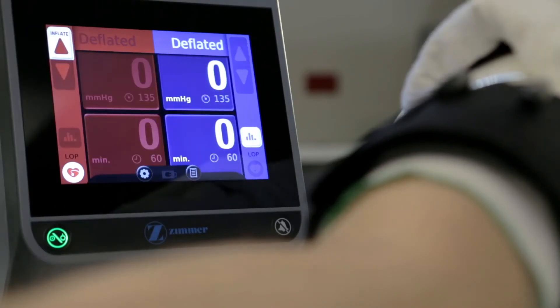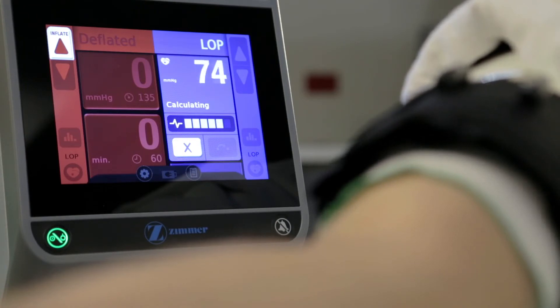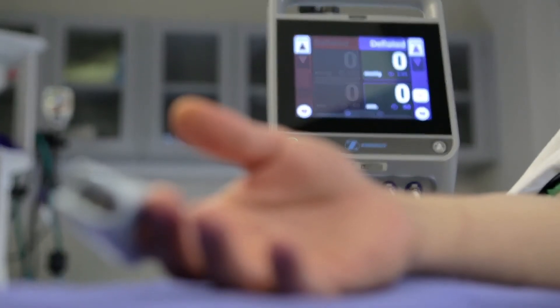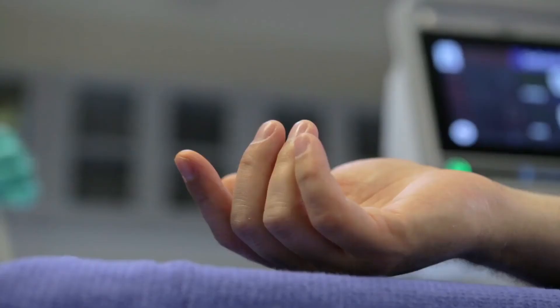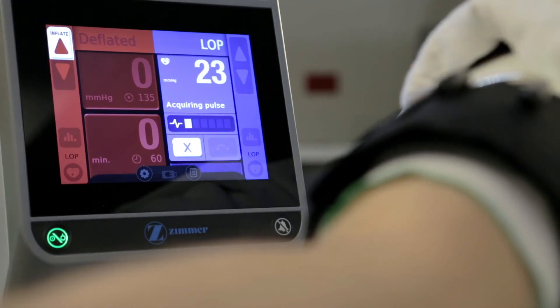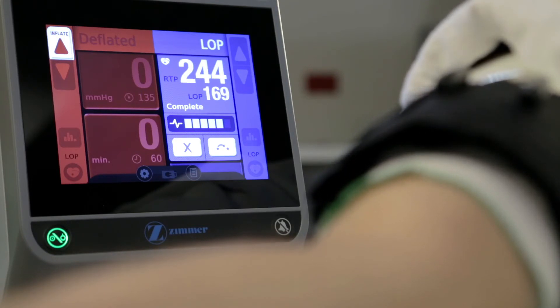The final pre-inflation procedure is calculating the limb occlusion pressure, or LOP. LOP is the lowest cuff pressure at which complete blood occlusion occurs in the operative extremity. Calculating LOP is easy and can be done prior to the patient being draped. Ensure that the LOP sensor is plugged into the ATS 4000 and that the tourniquet cuff has been placed on the patient. Attach the sensor to the patient's operative limb — for lower extremity surgery, the pulse sensor is typically applied to the second toe; for upper extremity surgery, to the index finger. To activate the LOP feature, tap the LOP icon on the display for the appropriate cuff. The ATS 4000 begins to inflate the cuff incrementally until the sensor detects the absence of a pulse. The tourniquet machine then calculates the LOP and allows the cuff to deflate.